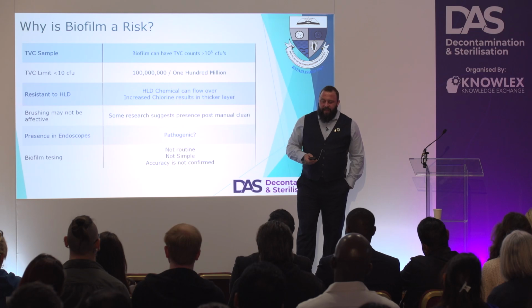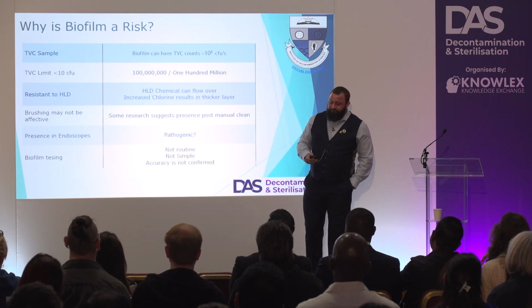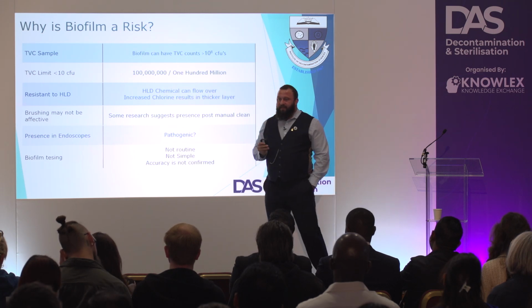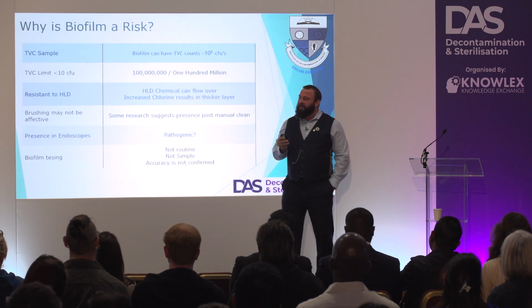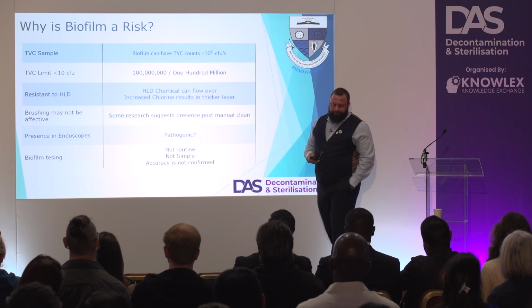The biggest problem we have is that testing for biofilms is not routine, it's not simple, and there's a massive issue with the accuracy. So we can't even detect if we've got a biofilm at the moment, and that's why it's a challenge.